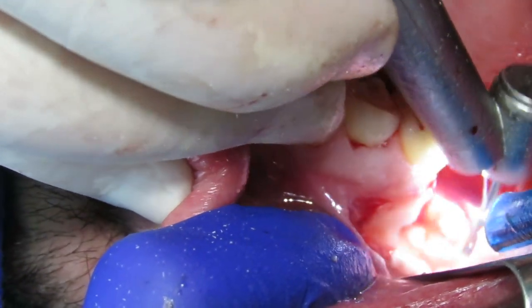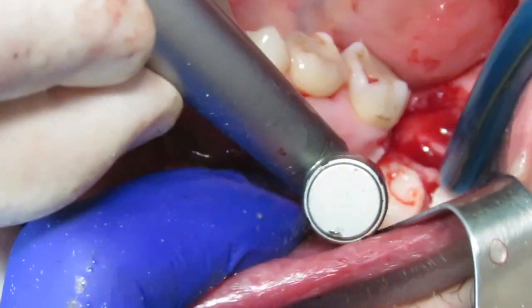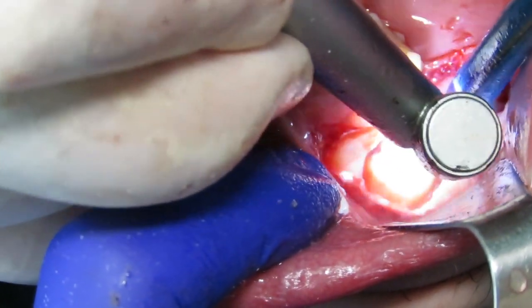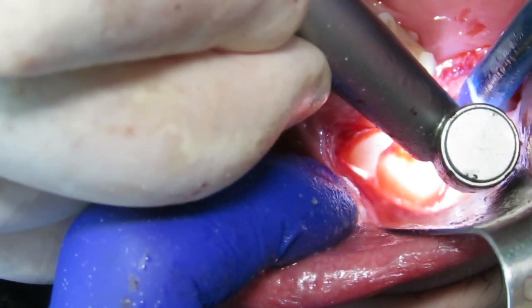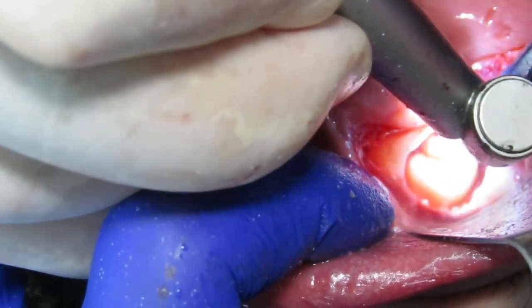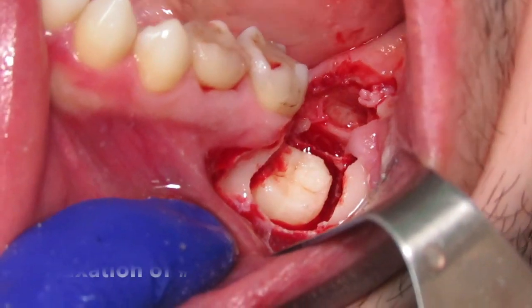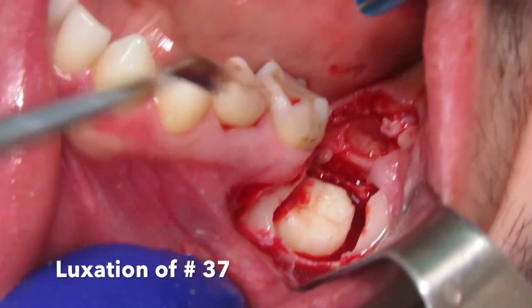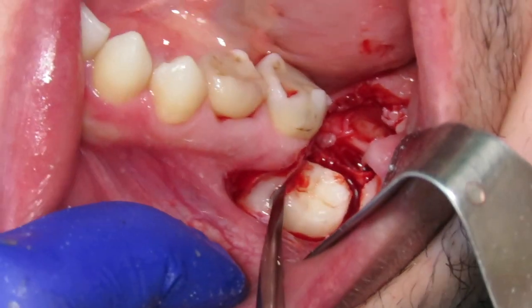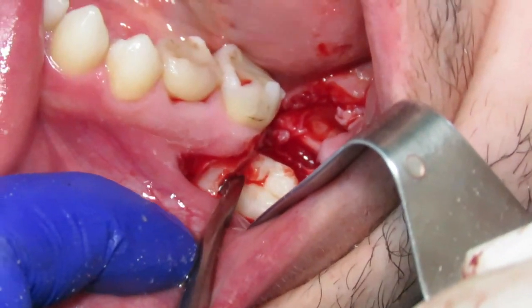Bone is removed on the buccal side and on the mesial side in order to place an elevator and try to luxate the tooth. Bone on the lingual side is removed to facilitate the extraction. And then using an elevator or a separator in that case, we try to luxate the tooth. And in fact, the tooth was not ankylosed and could be removed in one piece.